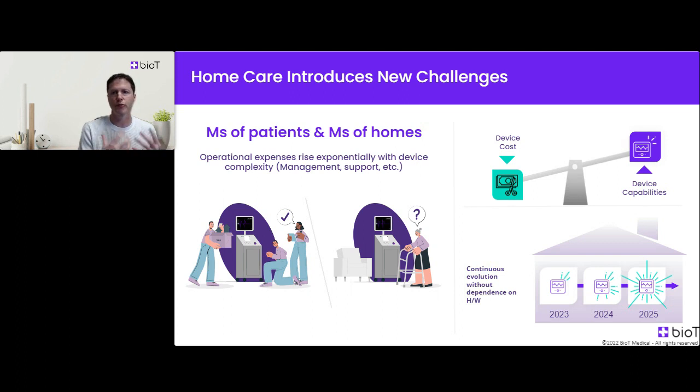It should also be foolproof, which means usually being far more developed, rounded, robust. Secondly, usually patients who get a home use device are chronic patients, and this means that they may be using the device for over a decade, hopefully, and this brings a huge challenge of maintenance.